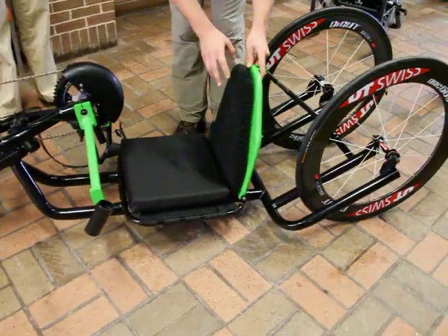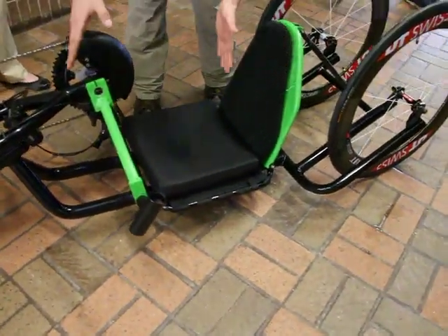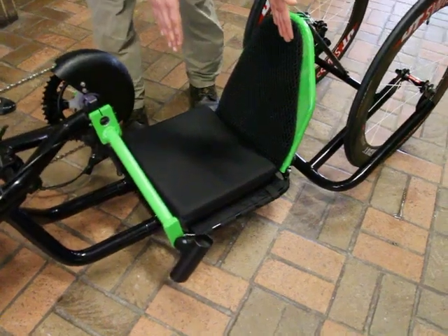We also have an adjustable seat that's quick and easy to remove, primarily for reliability and transportation within the hand cycle community. A lot of these innovative ideas are new and everybody's really excited about it — we're trying to keep them up like the Achilles team.